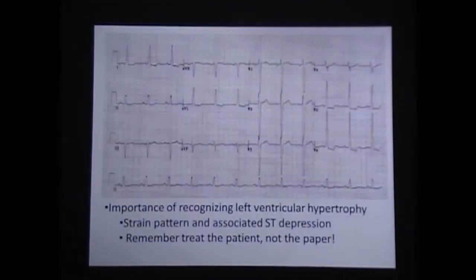Now, did any of the cardiologists that you talked to actually give numbers for how deep that deflection is on your S wave to diagnose it as LVH? My S waves in V1 through V3? Yeah, I've heard if your downward deflection is 2 times what your upward is, then that would qualify, or is it just the overall picture? Because for us, they didn't give me numbers, and there were a lot of different criteria and mathematical stuff that I didn't add, and I don't actually remember.